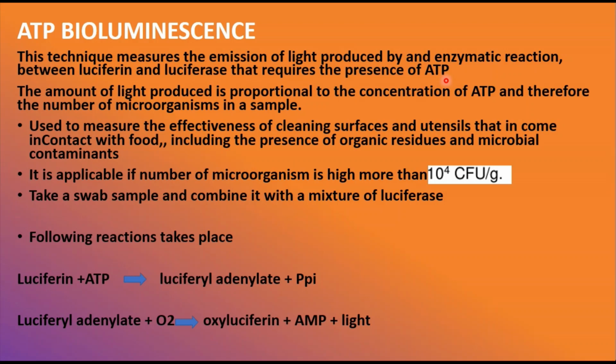So the ATP disappears within 2 hours after the cell death in any cell. So once the cell is dead, the ATP also disappears within 2 hours. So in this ATP bioluminescence experiment, the ATP is going to be quantified by measuring the light produced through its reaction with the luciferase enzyme. So here I told you the luciferase, an enzyme naturally occurring in firefly, for example, using an instrument called a luminometer, and the amount of light produced is directly proportional to the amount of living organism present in the sample.